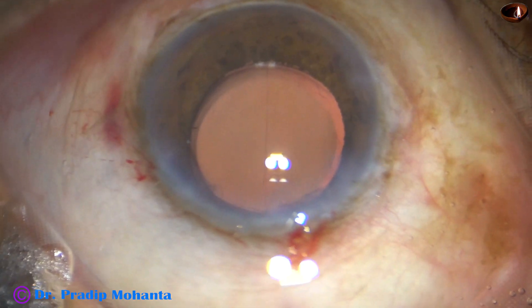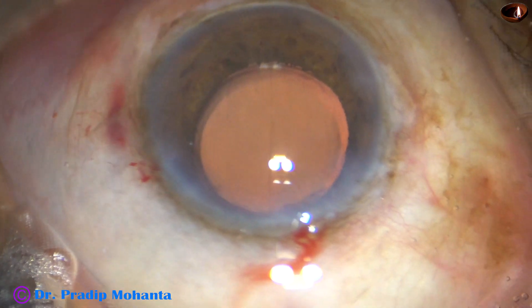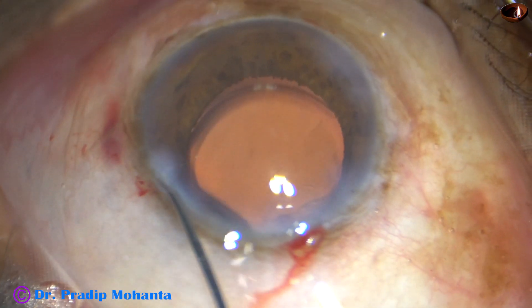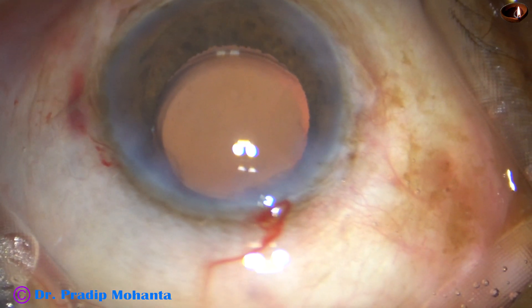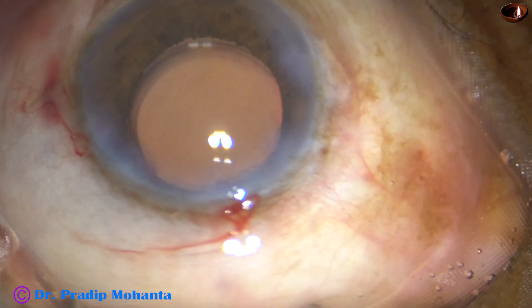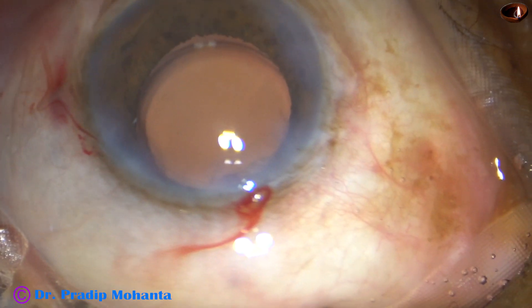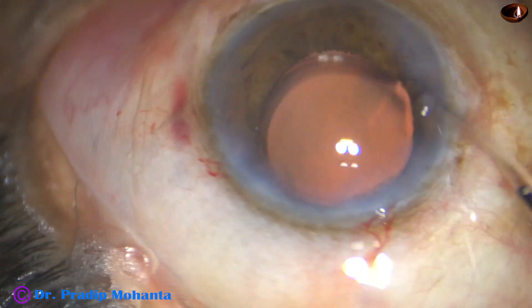Now using irrigation and aspiration together, this removes 100% of the viscoelastic from the anterior chamber. This is a little bit of moxifloxacin. Then the side ports are closed by corneal stromal hydration. Always hydrate the scleral side of these incisions — if you hydrate too much or hydrate the corneal side, there is a possibility of DMD, Descemet's membrane detachment.